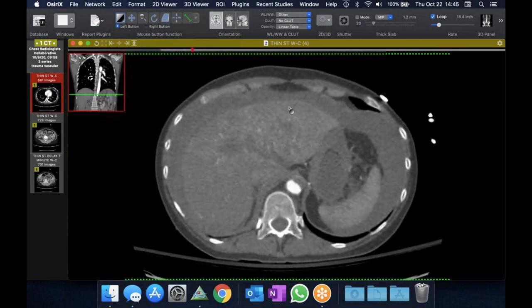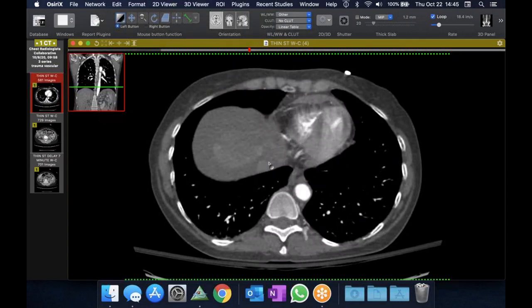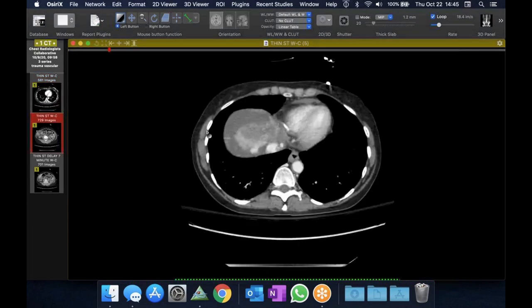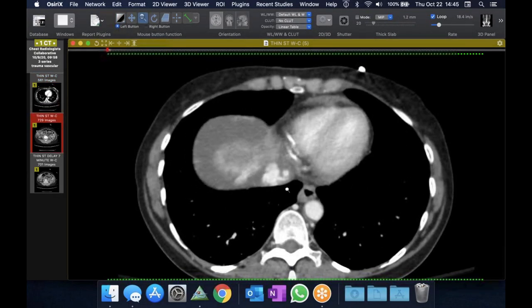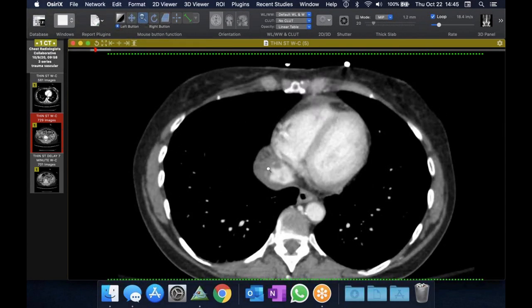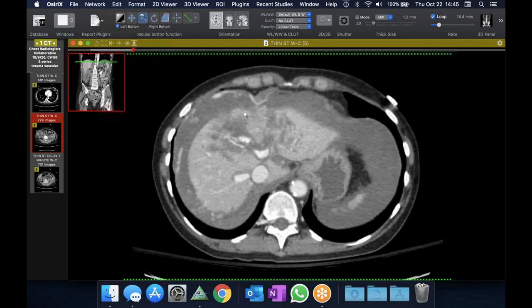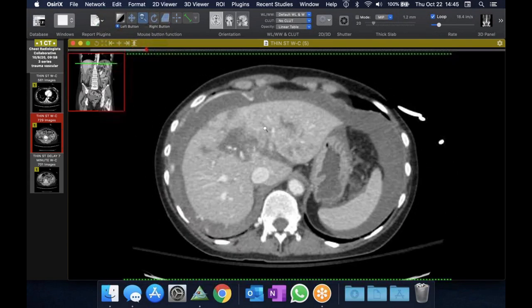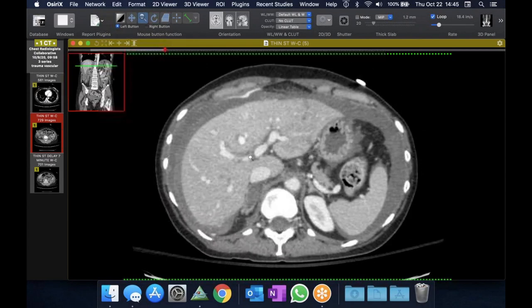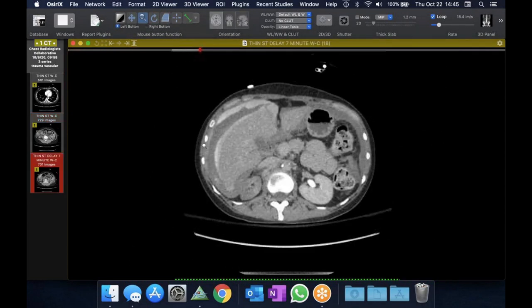And then just right here, there's a funny blood right at the IVC. So this was on the chest CT. But if you look on the abdominal CT, which is done, of course, at a later phase, we see lots of blood where the IVC should be, and this irregularity here and this abnormal thickening. So this is an avulsed IVC with severe hepatic laceration and blood in the peritoneum. Unfortunately, this patient ended up dying rather quickly as a complication of this.